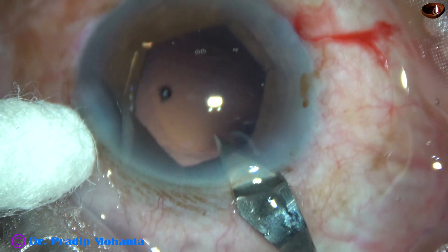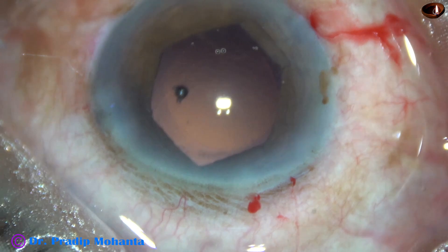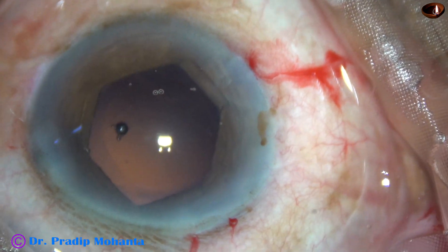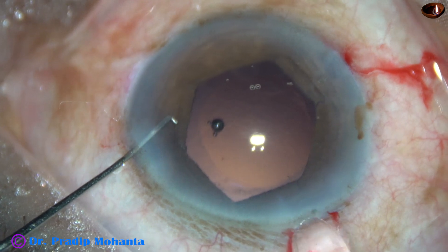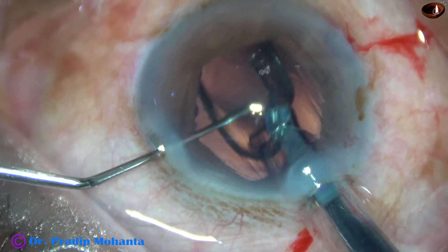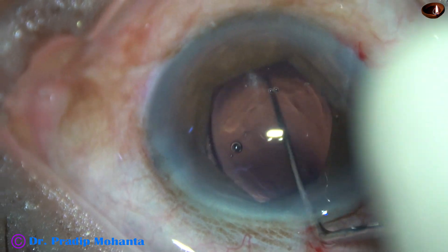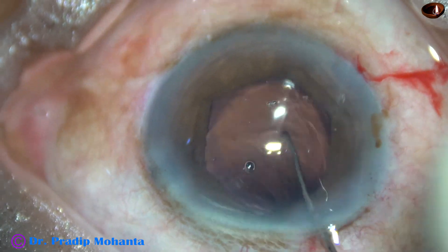This is a very important step. When there is a B-HEX, we must enlarge the main wound so that the tip of the cartridge goes inside beyond the flange, which is just in front of the main incision. The trailing haptic should be delivered beyond the flange. The flange has gone into the capsular bag and has not been trapped by the haptic. The intraocular lens is dialed.